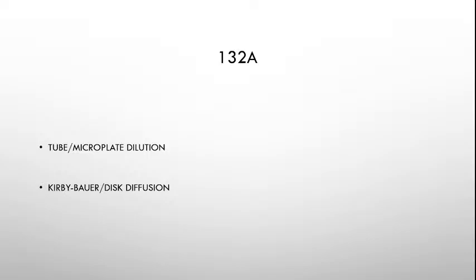Microplate dilution is basically spectrophotometry. So what blocks the light source from reaching the endpoint of the spectrum of the readout meter is the growth of the microorganisms, right? So that's the principle. If I'm not mistaken, for BD Phoenix, it reads the microplates every 8 hours. So you'll see cards like your passport, the size of your passport. Of course, you guys have passports, right?